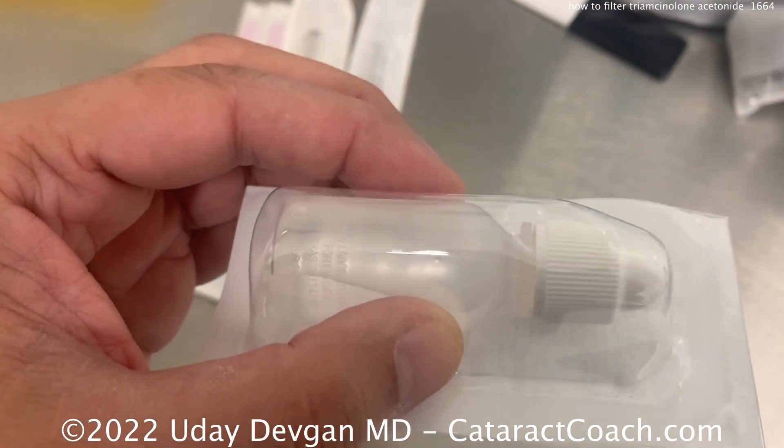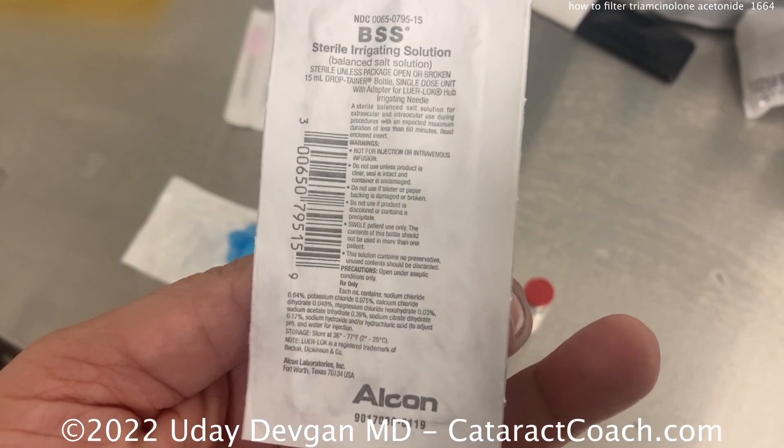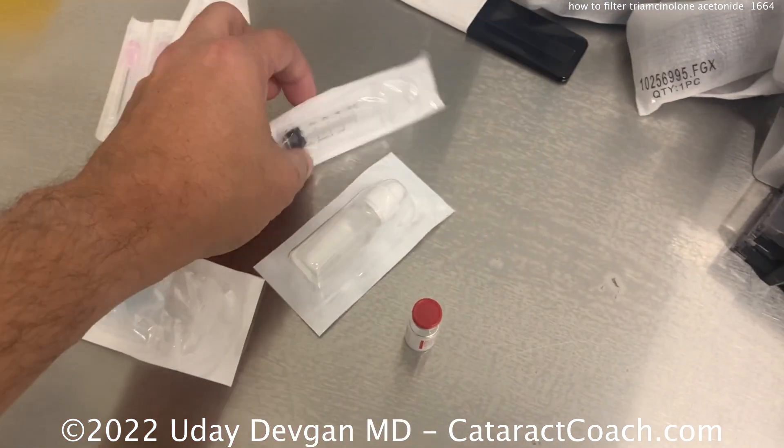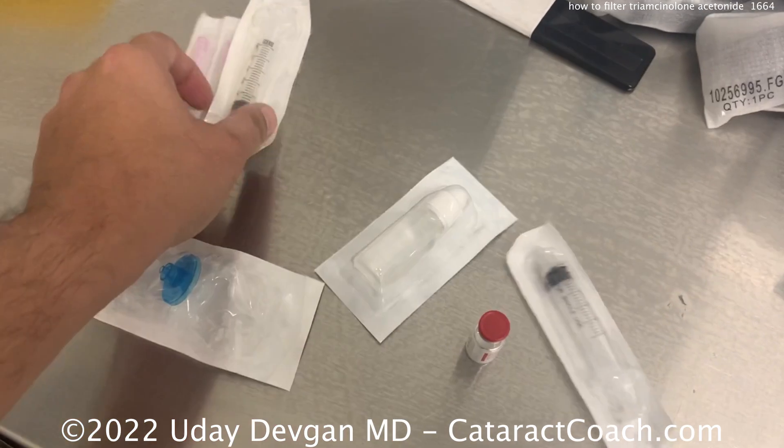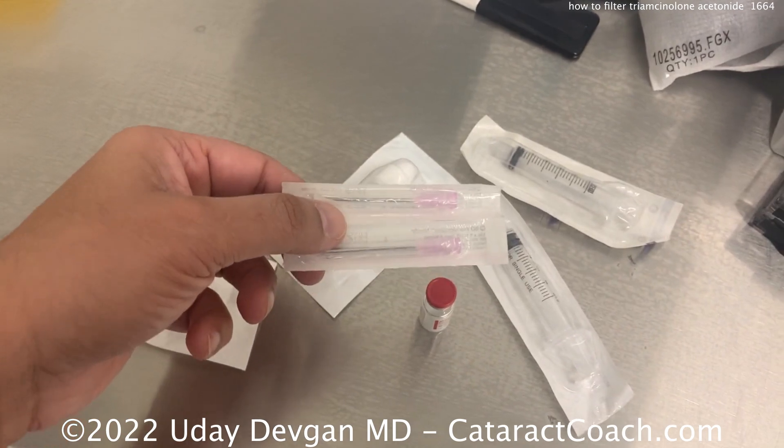Here is a bottle of BSS, balanced salt solution — that's the sterile product from Alcon. And then we have two 5cc syringes. Everything here is obviously sterile, and two 18-gauge needles because those give you a lot of flow.